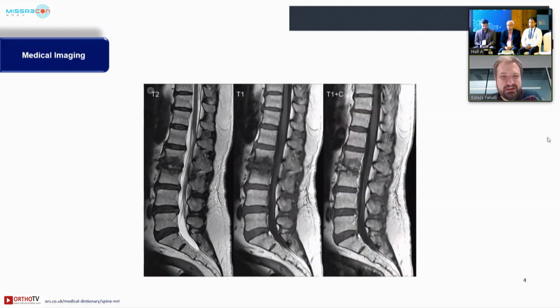In a, let's say, classic way, how you might look at the MRI of, in this case, spine, with scrolling through the slices. This works well for some pathologies or problems. If you are looking at disc hernia or other issues where you are really interested in seeing a cross-section through the data set, this works quite well.